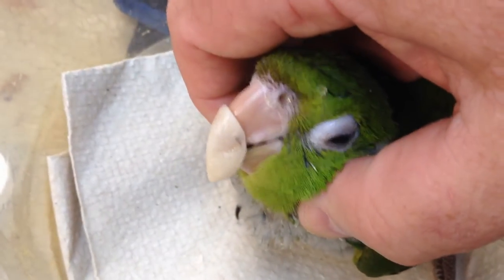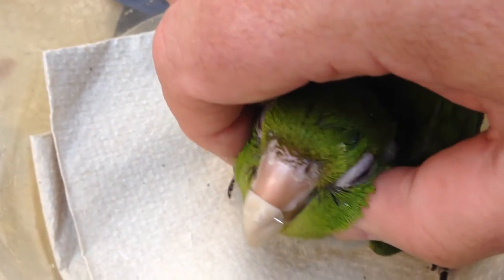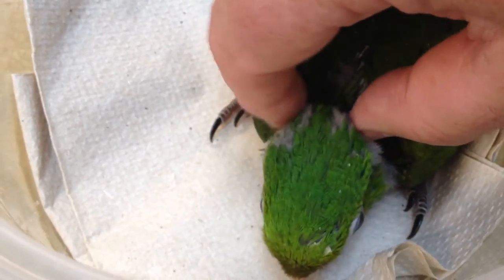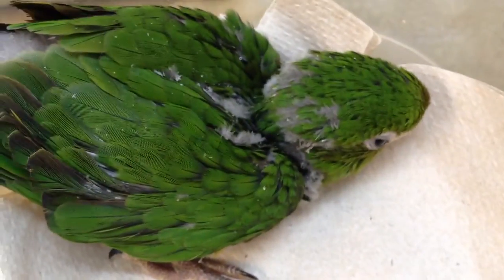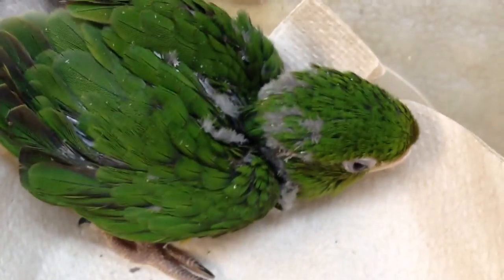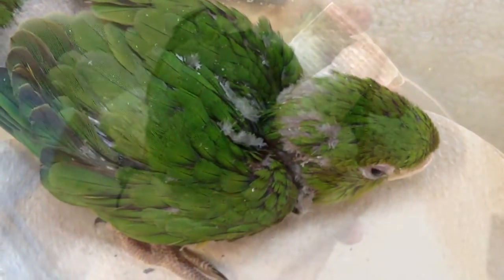So there we go. I smoothed it up as best I could without letting it get so thin that it wouldn't work. This is probably the first of a few installments and we'll get to see how this bird's beak trains to go back the way it's supposed to normally. So far, so good. This will be a cool case.